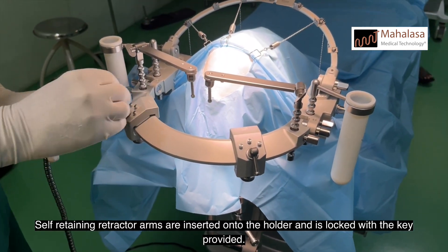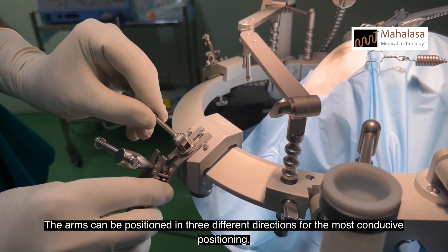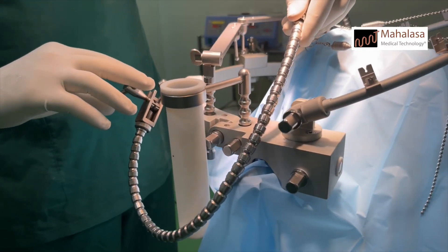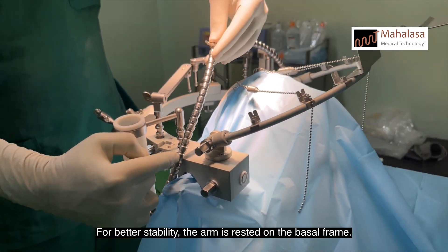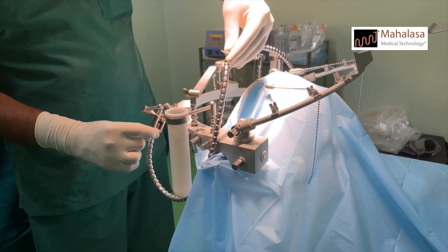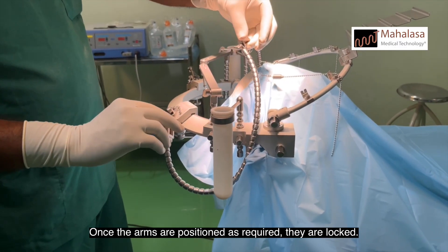Self-retaining retractor arms are inserted onto the holder and locked with the key provided. The arms can be positioned in three different directions for the most conducive positioning. The arm is very flexible to position. For better stability, the arm is rested on the basal frame. The tension of the retractor can be adjusted here. Once the arms are positioned as required, they are locked.